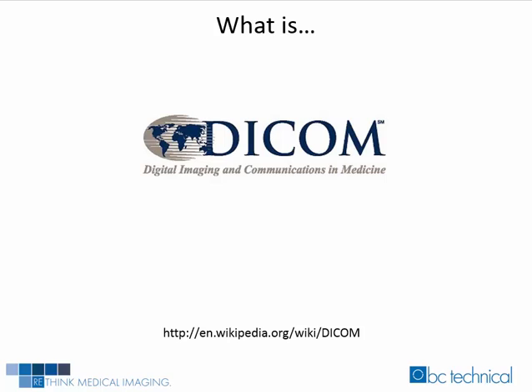Digital imaging and communications in medicine, aka Dicom, is a standard for handling, storing, printing, and transmitting information in medical imaging. It includes a file format definition and a network communication protocol. The communication mode used is the TCP/IP protocol. Dicom files can be exchanged between two entities that are capable of receiving image and patient data in Dicom format. You may want to research more on this topic by checking out the website on this slide.